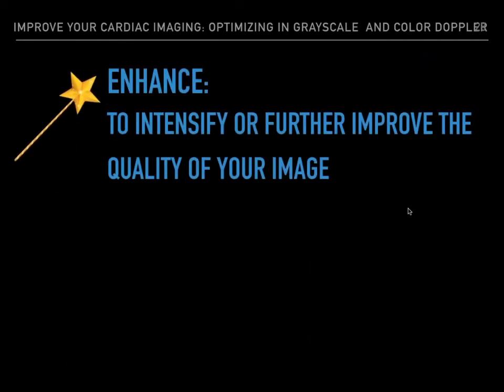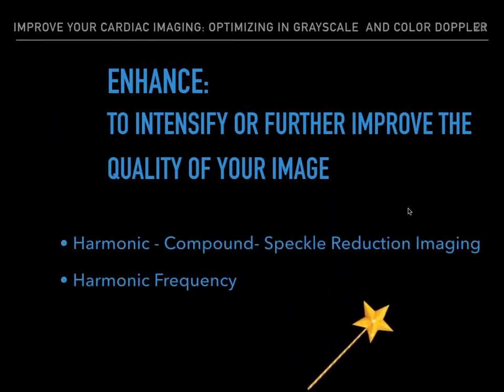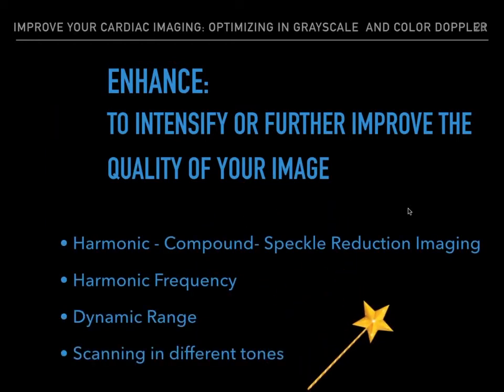So enhance, by definition, is to intensify or further improve the quality of your image. And this is all done just by doing a few adjustments to these few settings: harmonic compound speckle reduction imaging, harmonic frequency, dynamic range, or even scanning in different tones.